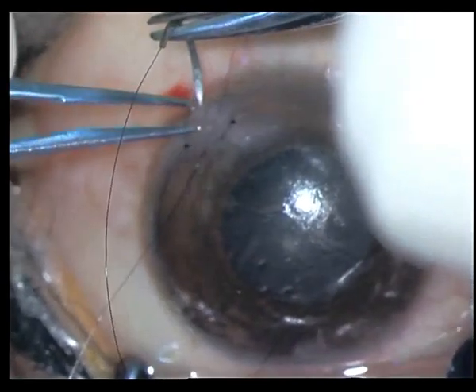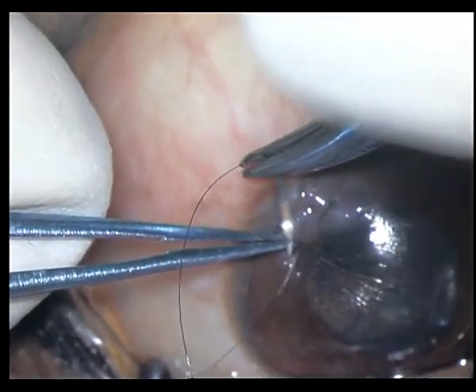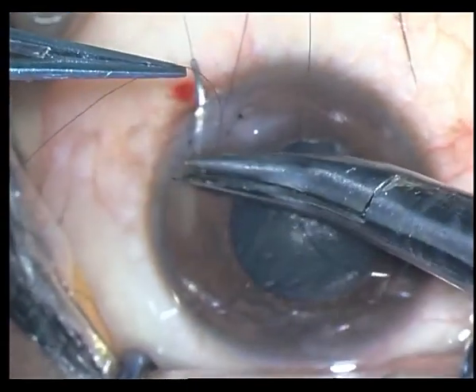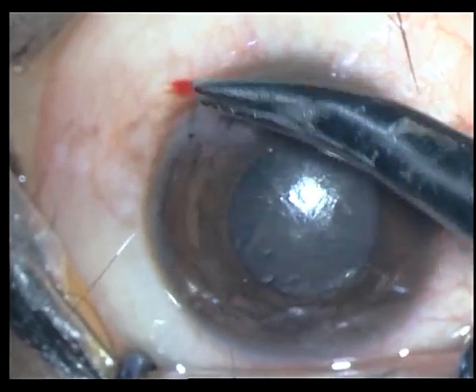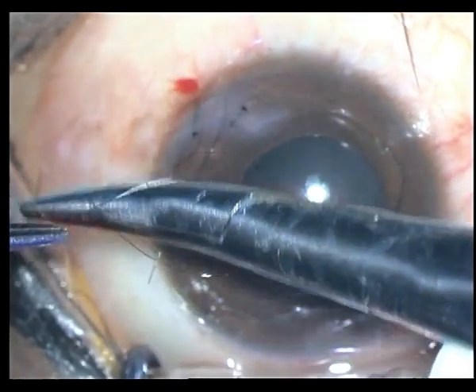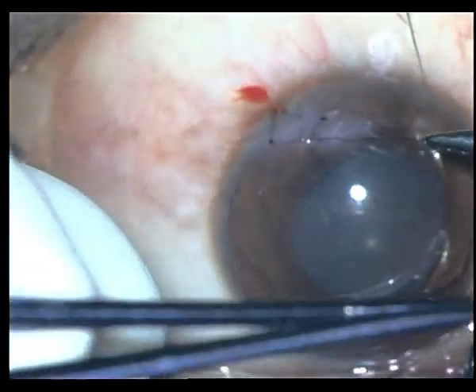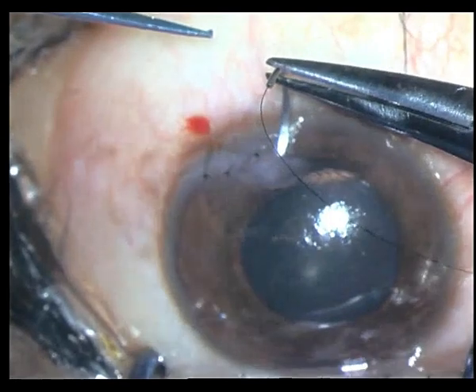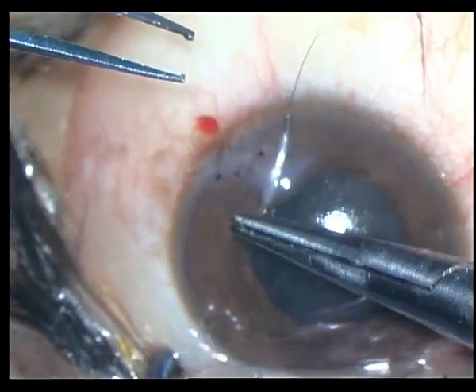Hence I am using a purse string suture to close that central gap formed by this triangulated tear. This is important — if you try to suture that apex you will just start eating away into the tissue; it will just cheese-wire through it. So better go on all sides and put in a purse string suture through the healthier part of the tissue.